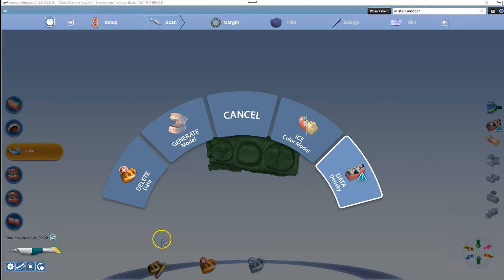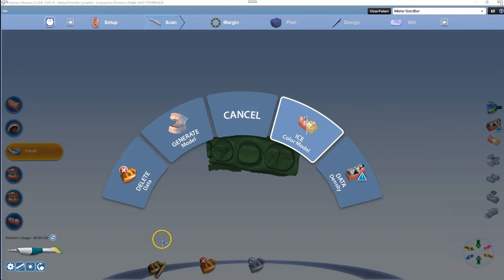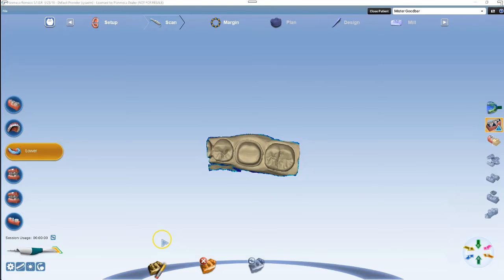With both buttons down, rotate the scanner clockwise or counterclockwise to highlight the desired option on the screen and release both buttons to accept the desired option.